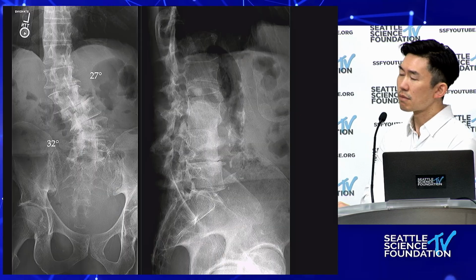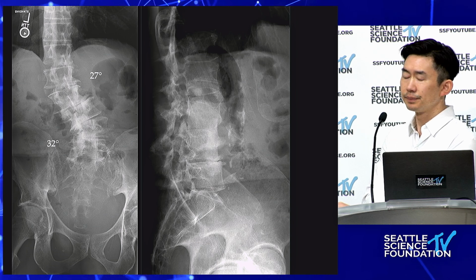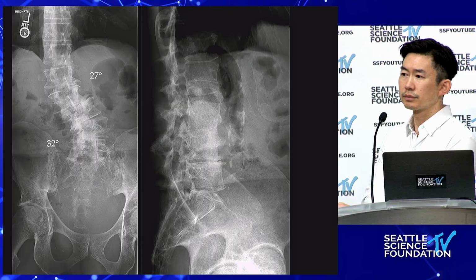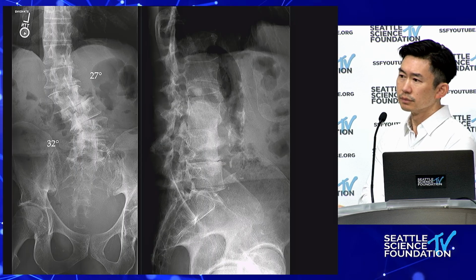But that's a great result, and the idea of pre-planning it, I think if we're not doing that, then you're in real trouble. And I don't think it's wrong at all to use the unit or the preformed rod, because I find you get a lot of correction when you're doing that, especially when you turn the patient prone, and I think it saves you. And I also notice, if you look at your cages, people always talk about the lordosis of their cages and what they're going to get. Those are not really highly lordotic cages. They're not hyperlordotic cages, but you still got a lot of lordosis because of the placement of the cage. So I think a lot of things go into getting that lordosis too.